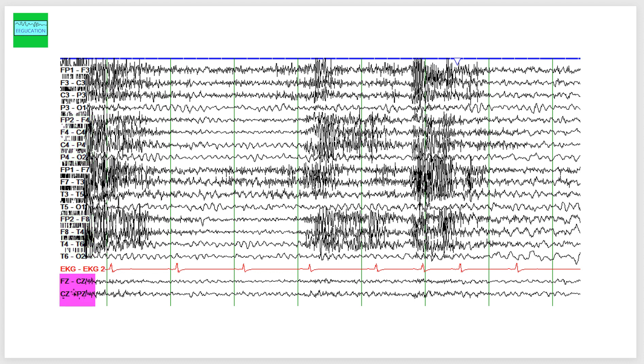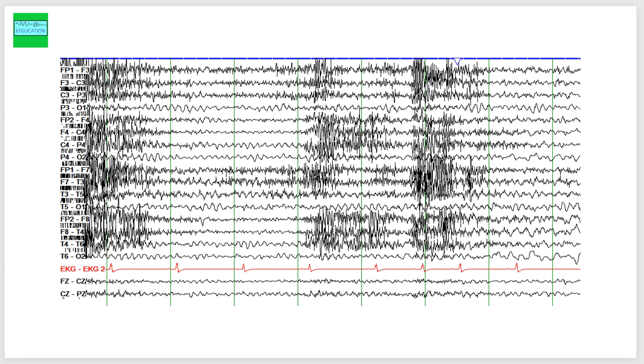I want you to pay specific attention to the ECG lead. Look at the rate now, look at the rhythm now, and see how it changes as the EEG progresses. Compare the left side of the brain with the right side of the brain and see if you see any asymmetries or abnormalities.